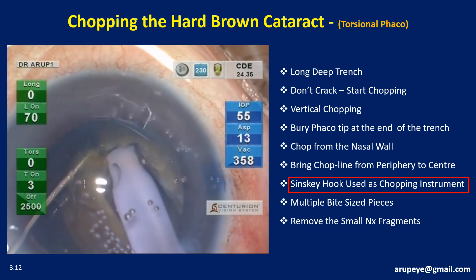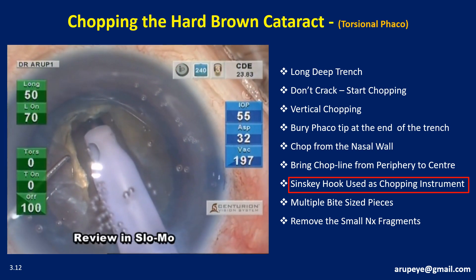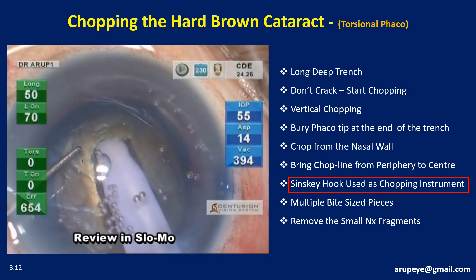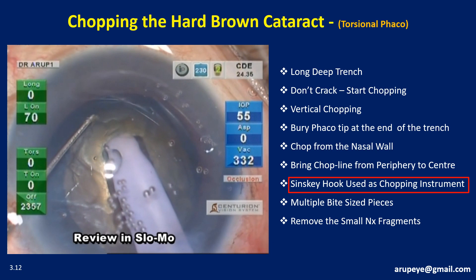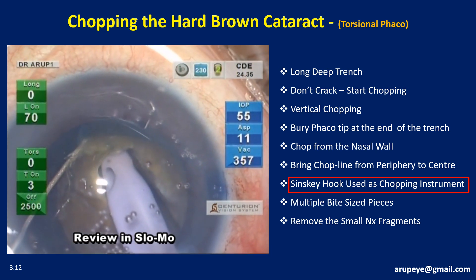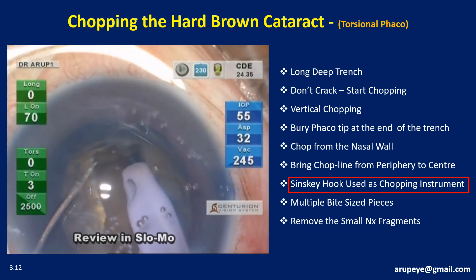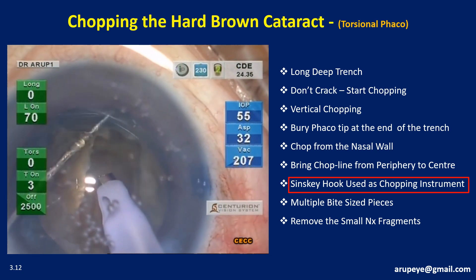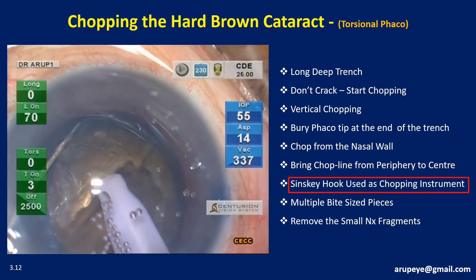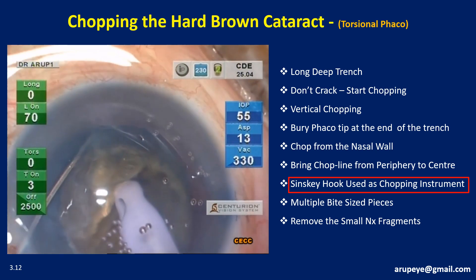The balanced tip is drilled into the distal wall of the groove, thereby pinning down the nucleus for chopping. The chopper, after engaging with the nucleus surface, slices down towards the phaco tip, and just before the two tips come together, they are moved apart, thereby creating a cleavage line which propagates towards the center. It is not necessary to struggle to have the cleavage line run all the way across to the opposite periphery at this stage.